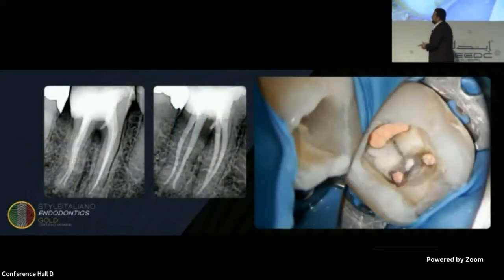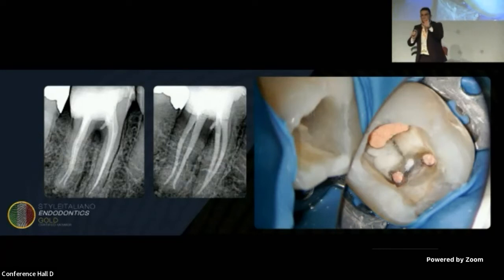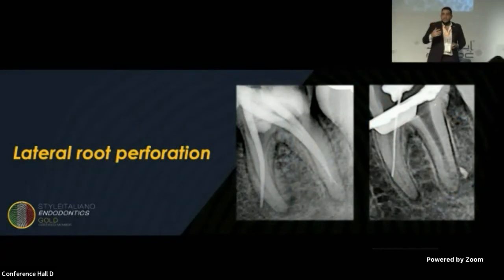And at the end, I cleaned that furcation canal, which is coming from the floor, using ultrasonics. For sure, I can do shaping in that small part, and I sealed it using putty bioceramic material. So, as I said, we should adapt our knowledge to the anatomy.